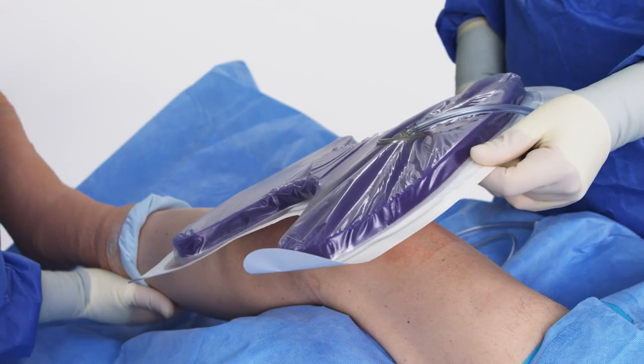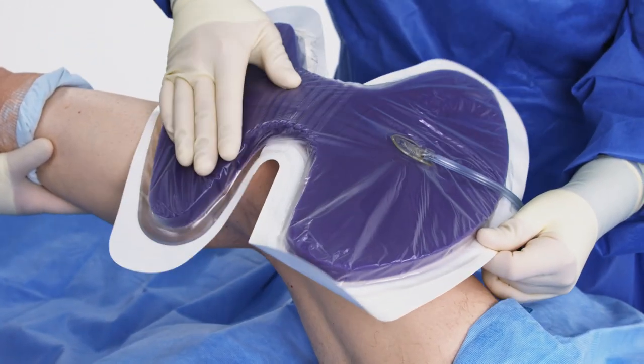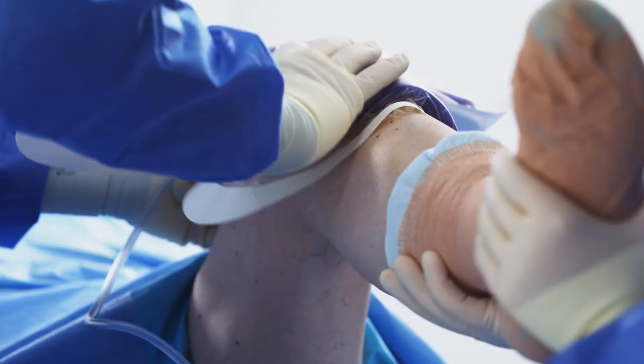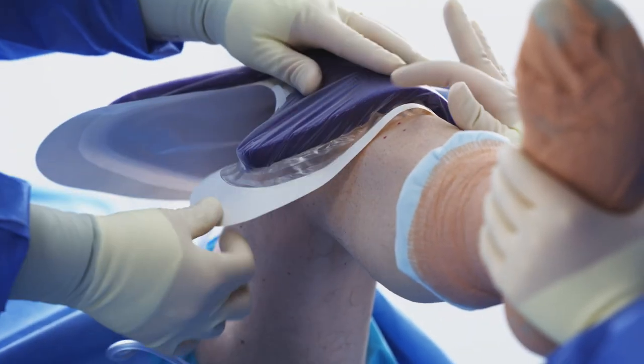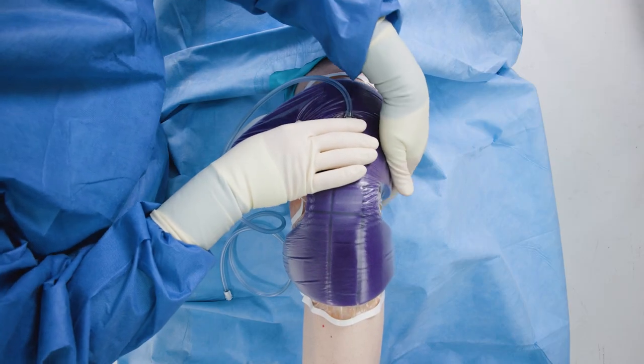It's important to keep the drape out of the knee fold to improve both patient comfort and maintain a proper seal. Apply the Praveena Restore Arthroform dressing from the bottom up, applying the distal portion first then the proximal portion.